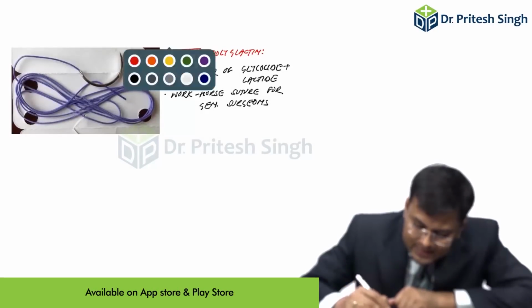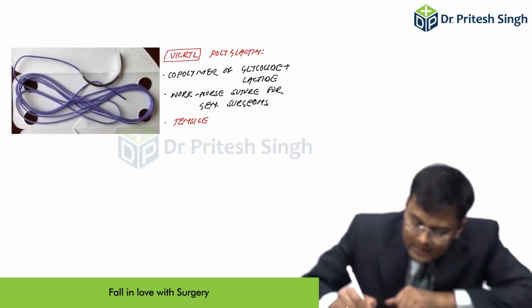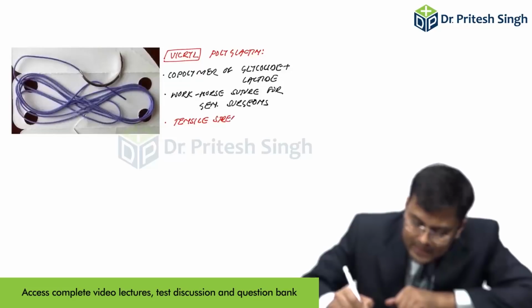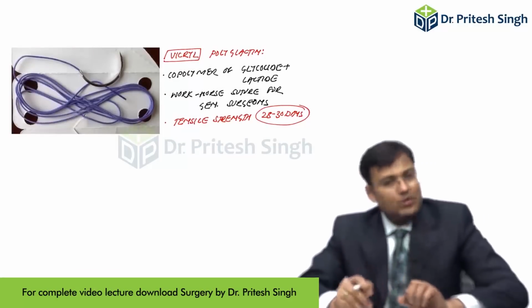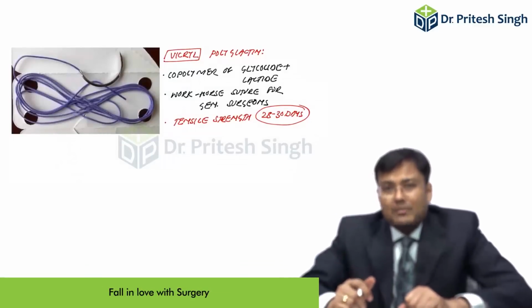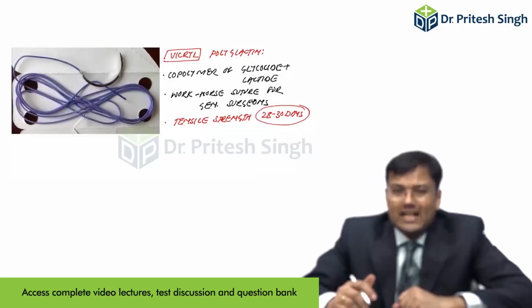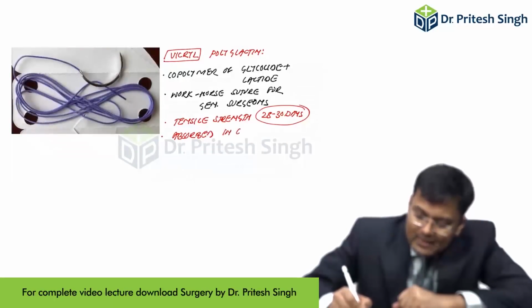It maintains its tensile strength for 28 to 30 days, and it's absorbed in 60 to 90 days.